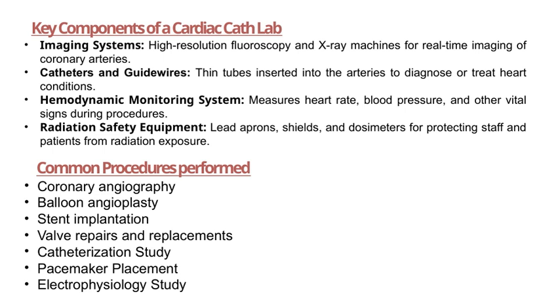It allows us to visualize blockages or abnormalities in the coronary arteries. We also perform balloon angioplasty to open narrowed arteries and stent implantation to keep them open long-term. Other important interventions include valve repairs and replacements, catheterization studies, pacemaker placements, and electrophysiology studies. Each of these plays a crucial role in managing different heart conditions. Altogether, these components and procedures highlight how a cardiac cath lab is equipped to diagnose and treat a wide range of cardiovascular issues effectively and safely.